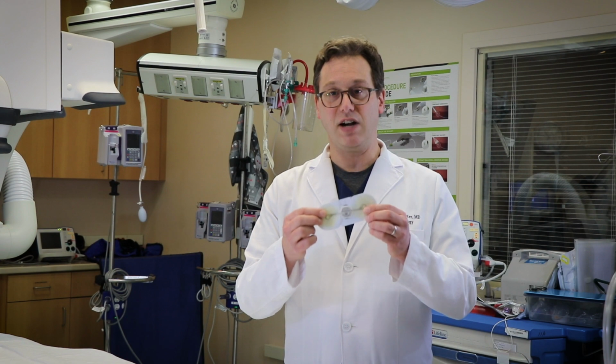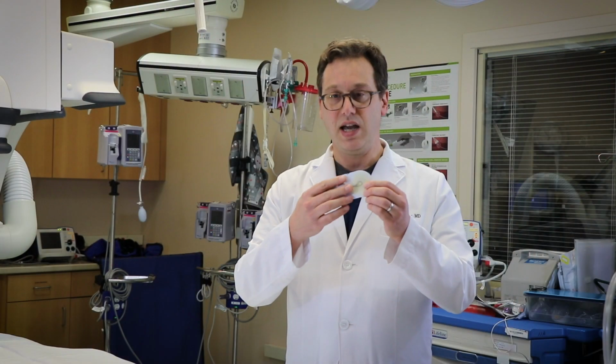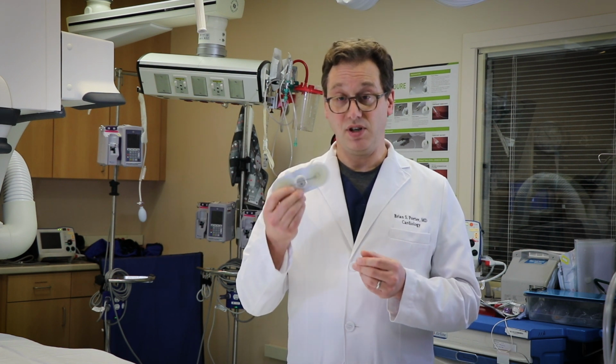So for patients who are having infrequent symptoms, we may recommend a slightly different test related to an EKG, which is a patch monitor. And a patch monitor looks like this little sample that I have right here. The patch monitor, it's a little bit bigger than a credit card, and it sticks right on your skin, right over the heart, like this. The patch monitor can be worn for up to 14 days. Believe it or not, it's waterproof.